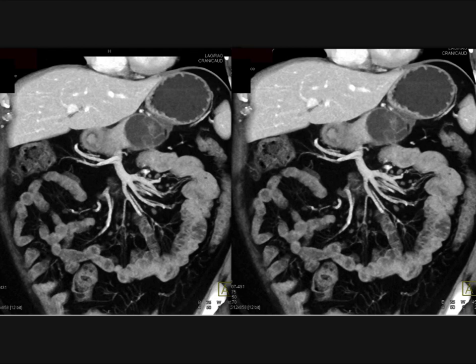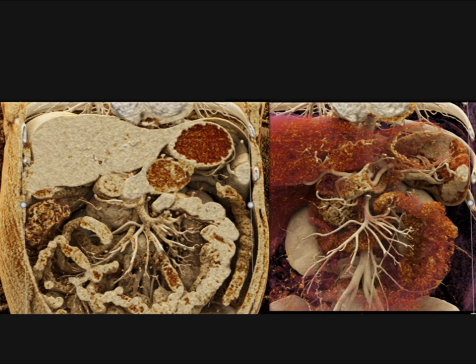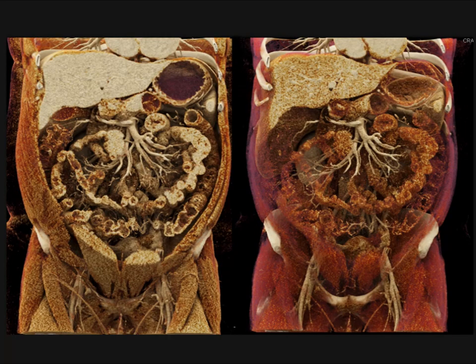I find that reconstructions — at minimum coronal views, but also 3D volume rendering — work very nicely, as you can see in this example. Cinematic rendering is really good for texture display. The image on the left makes it very simple: we're dealing with an MCN that has a high chance of at least moderate to high-grade dysplasia. Whether this is cancer is hard to say definitively, but regardless, this lesion will be coming out. The vascular map on the cinematic rendering is nicely shown. This patient will end up with a distal pancreatectomy, saving the head of the pancreas. The cinematic rendering with 3D mapping can also help plan a laparoscopic approach.